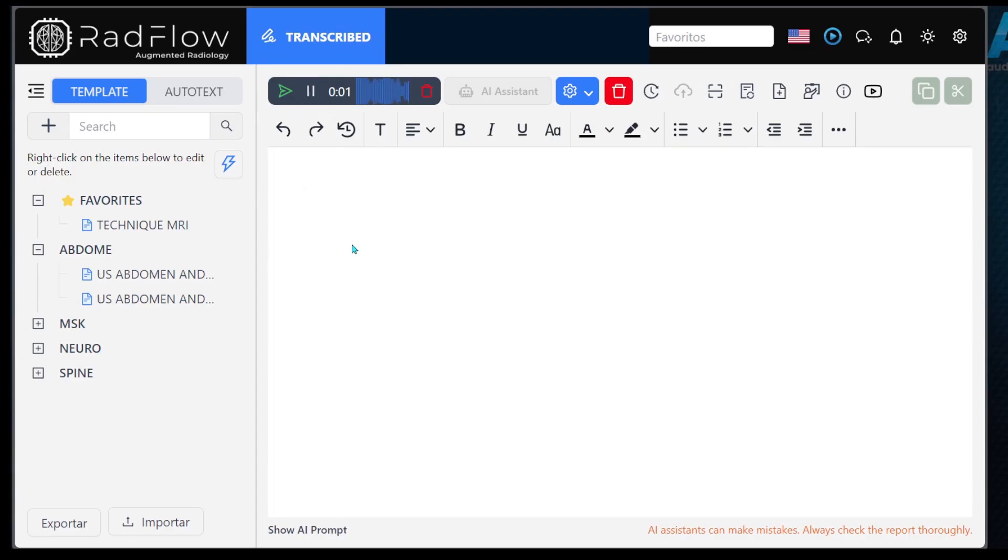Presence of a kidney stone in the upper pole of the right kidney, no, I mean the left kidney, measuring 0.4 centimeters.